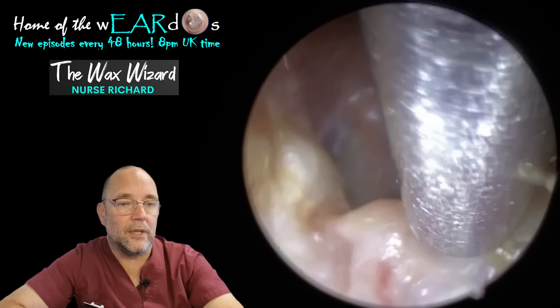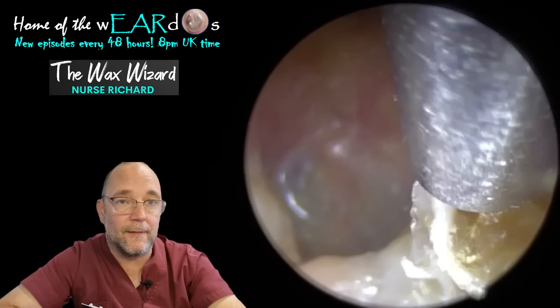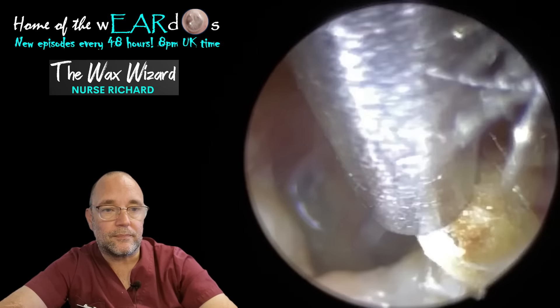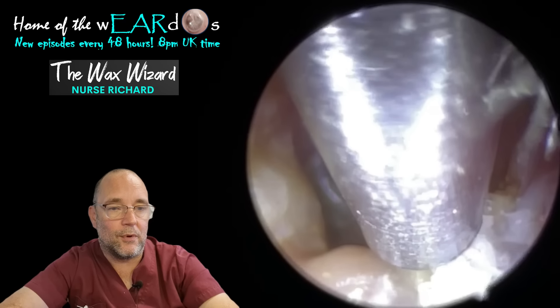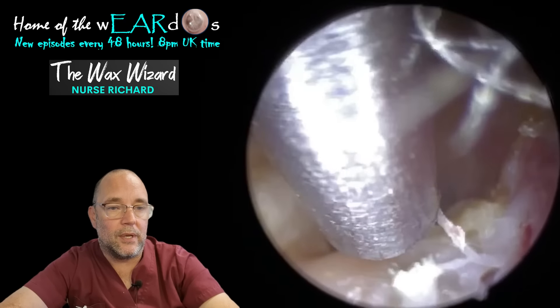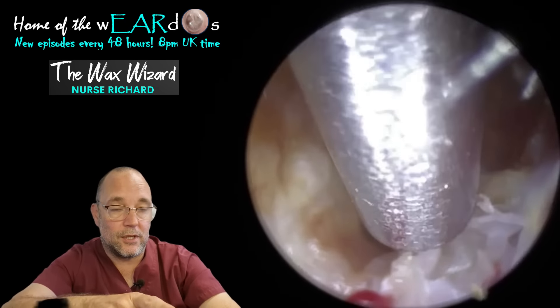Now, I've decided to start with what's left here, just at the right edge of this, because I don't want to go gung-ho in the middle of this. I just want to gently peel it away from the side, to see because I'm fully expecting it to reveal something. So you can see I'm just trying to get a grip there. I'm being ultra-cautious, obviously, because it's delicate, this stuff. And you will see - this is where the blood comes from. It's not because of anything I've done. It's kind of inevitable when you're pulling away something like this. So we're just gently peeling it away from the side, and it's coming away nicely. But as we go, the really mushy bit, just to the left-hand side of where I am now, you will see just disappear up the tube.